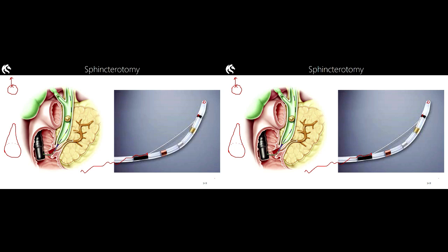Okay? A sphincterotomy involves cutting and cauterizing tissues, and so it's quite common for these patients, and I apologise for this mental picture, to either blow smoke out of their nose or indeed out of the anus. Okay? You will also get a somewhat enthusiastic smell because we are literally cooking flesh. So if you are of a somewhat gentle disposition and don't like the smell of cooking human, just be aware of that prior to going in. The other white meat.